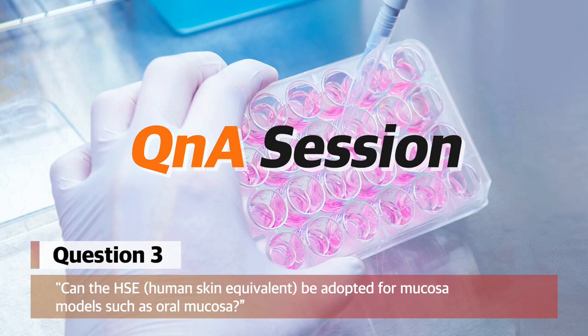I have some experience differentiating from the oral cells to some, not skin, but kinds of mesenchyme strain. So it probably can be possible to make HSE from that. But our lab actually tried some cell lines already, but we didn't actually succeed to make skin from oral mucosa. But there might be some possibility.